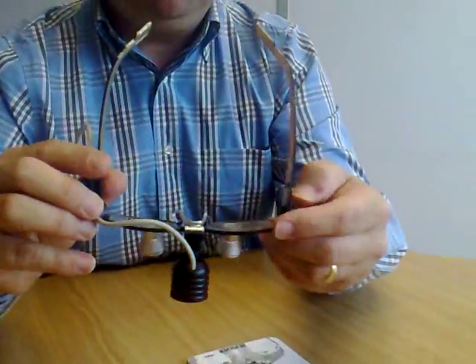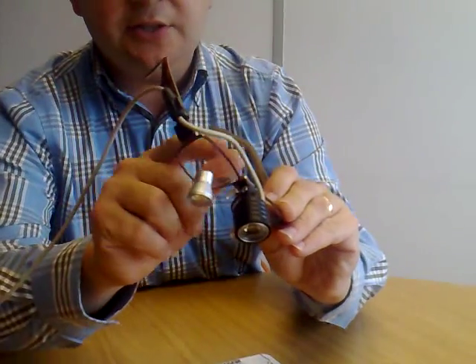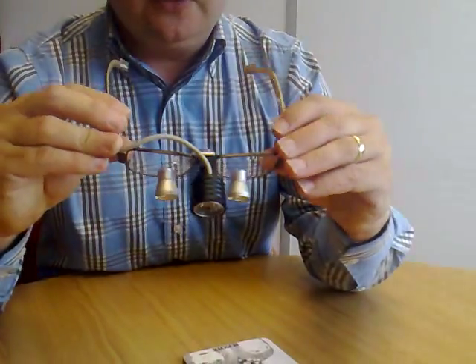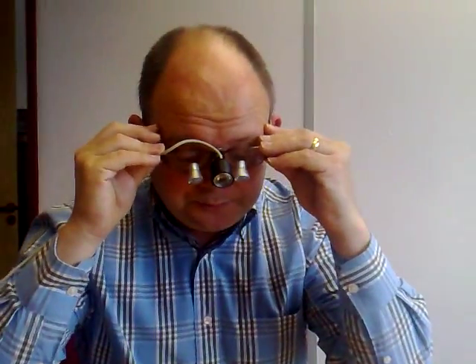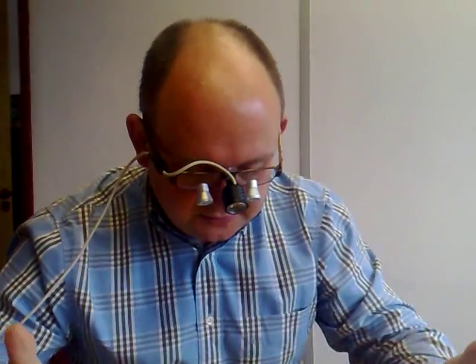What we're talking about here is you can see that this is the loop thing on the front. This is attached to the lens that you can see here. And what that enables the user to do is, obviously when they wear them like so, they can look through and see things closer up, whilst having their hands free.